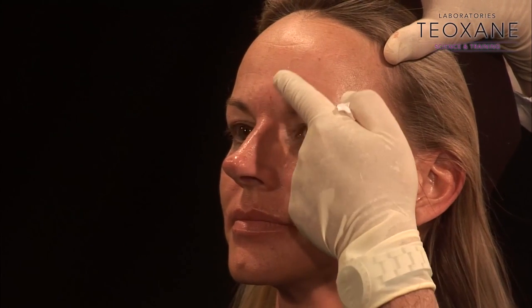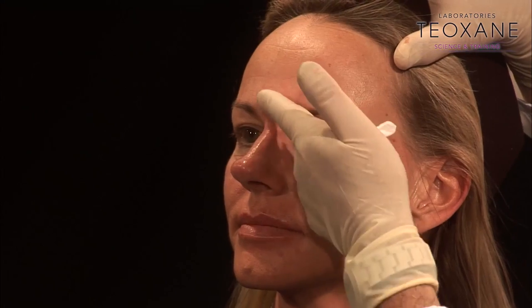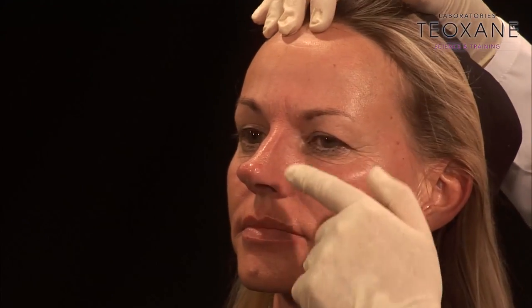Nice. Nose is nice. I think we have a good surprise with the nose. Yes, it looks nice. The RHA seems to be very smooth, more elegant nose. One thing that was important is the angle between the nose and the forehead here. It was too deep, so it's much more elegant. We have sort of what we used to call Greek nose. I don't know if the Germans like to call that Greek nose anymore.